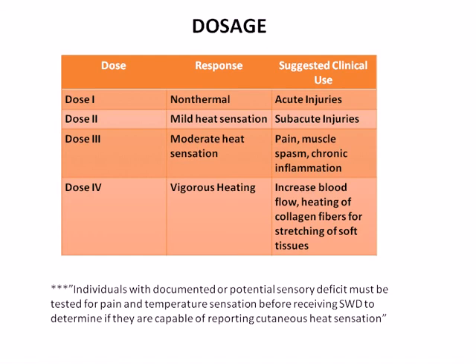So in diathermy, dosage is the amount of energy delivered to the body that is absorbed and converted into heat. Since this value is not easily measured, dosage is determined by the desired therapeutic effect and the patient's subjective response.